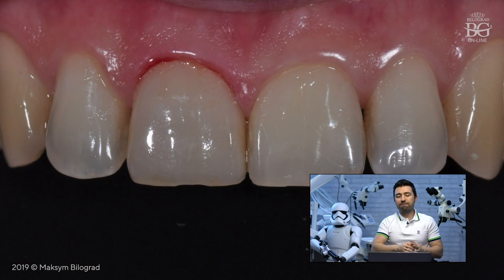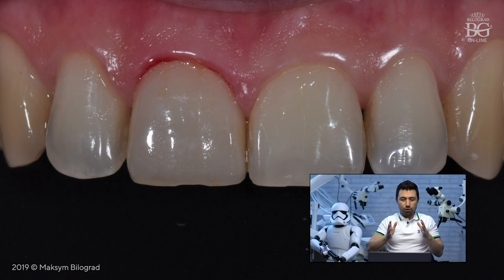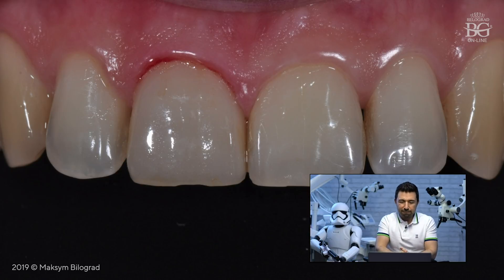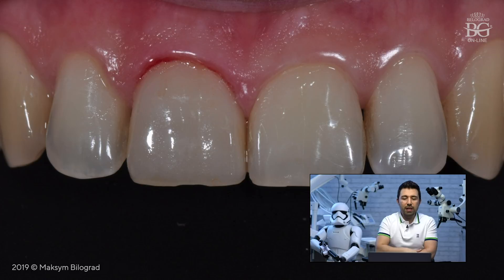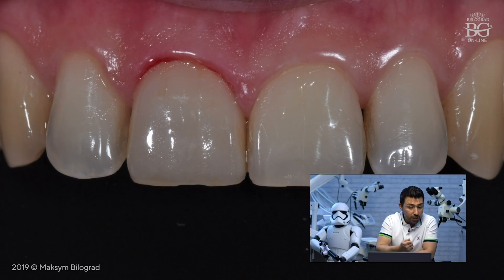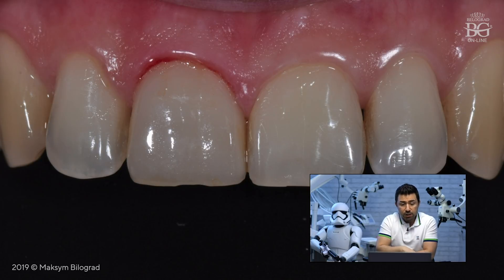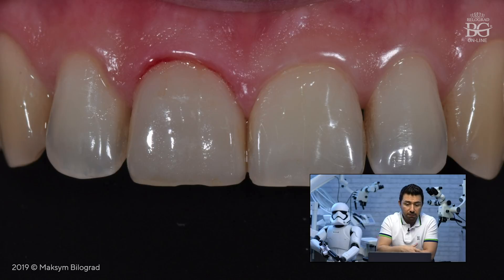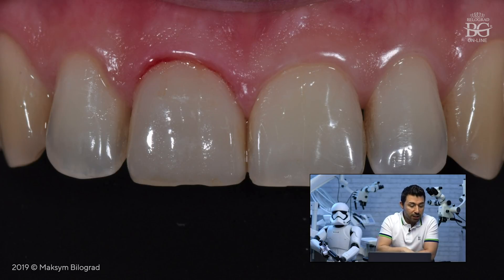This is the final picture from this case, straight after cementation. There is some small inflammation, and the tooth appears slightly grayish compared to adjacent teeth because the adjacent teeth were also isolated and experienced dehydration. The metal-free ceramic crown was very good in terms of shape and color matching the adjacent tooth.